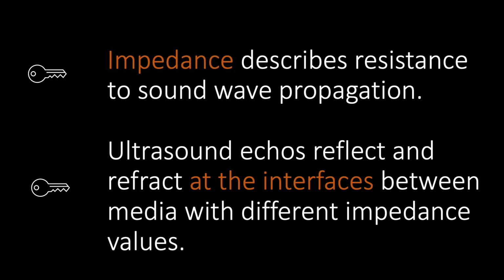I mentioned that sound waves travel differently through different tissues because of the factors inherent to that tissue. And that's a way to sort of summarize this idea of something called acoustic impedance. Acoustic impedance is like the friction through which waves have to travel. So, if you were walking through sand or through mud, you're going to be a lot more slow than if you were running on a track or on the sidewalk. In the same way, the sound waves travel differently through different properties because those properties have different impedances.